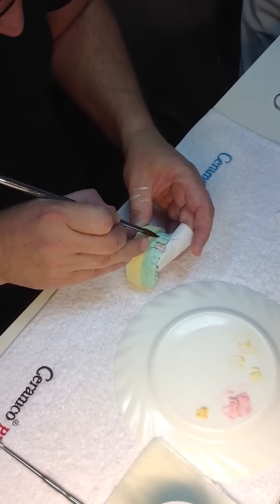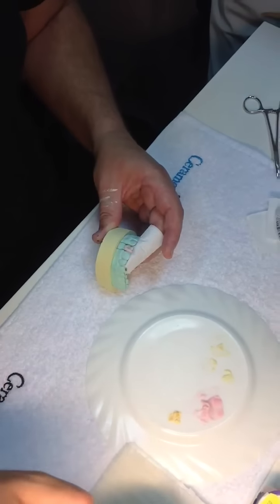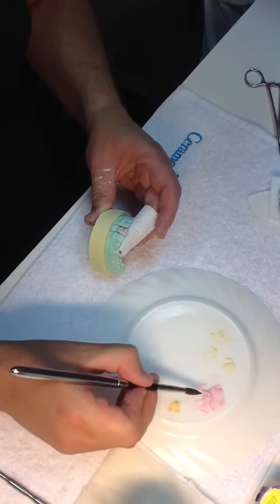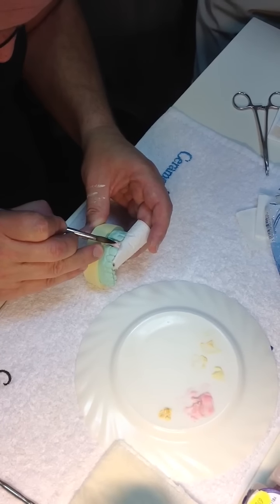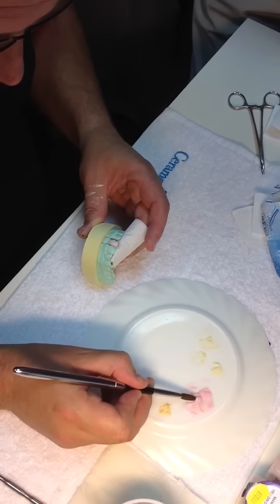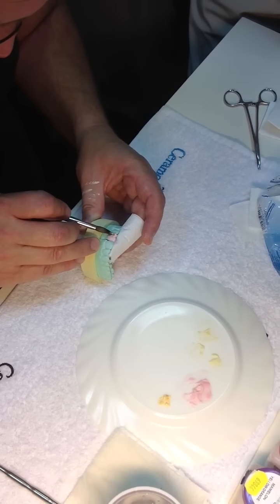If you have sealer on here, then you have some sort of die-release material. It's more fluid that can go into the porcelain. I prefer to leave it on the stone. I prefer not to isolate the adjacent teeth, because the stone just sort of acts as a natural sponge and removes moisture from the ceramic. If we applied isolator, the moisture would remain.